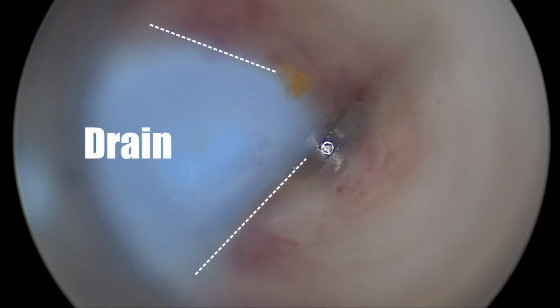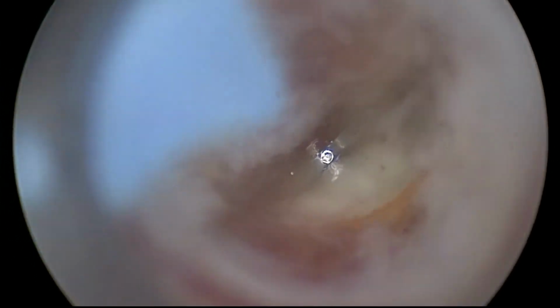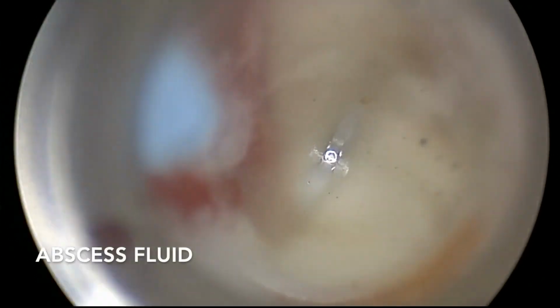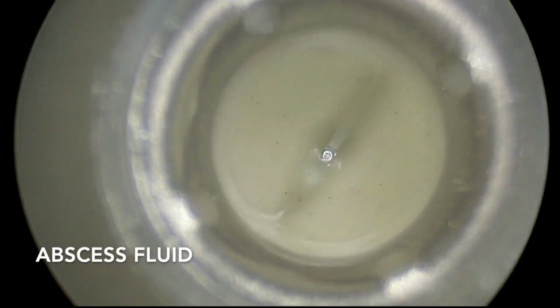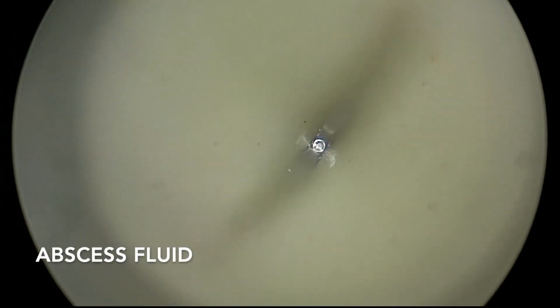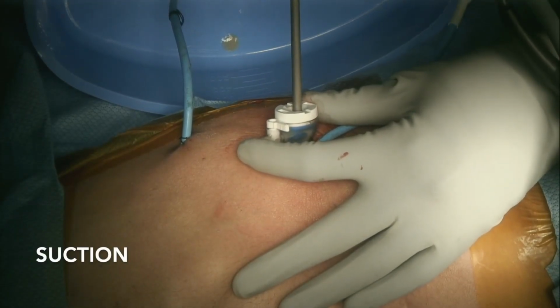A second 5 mm trocar could not be inserted for the camera because of the risk of injury to the descending colon, which was adherent to the lateral abdominal wall on the CT scan. The distance to the retroperitoneal abscess cavity was calculated using the camera and CT scan images.